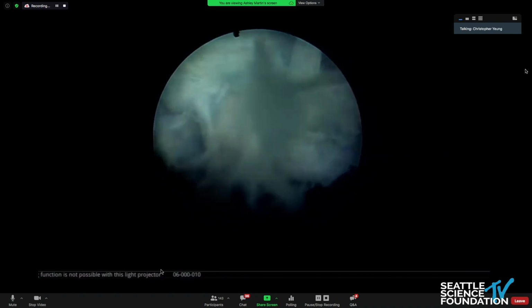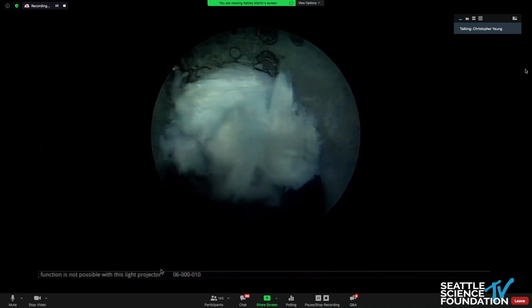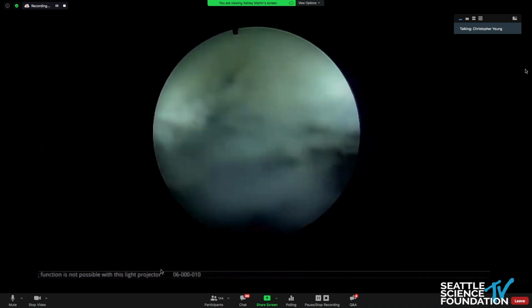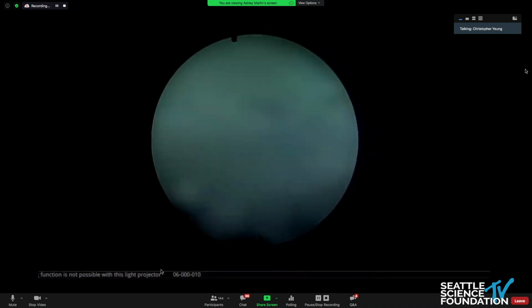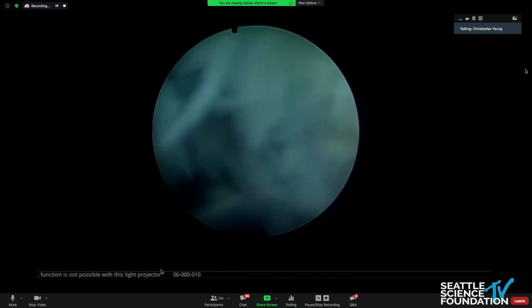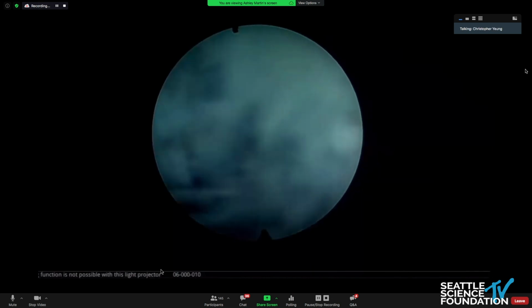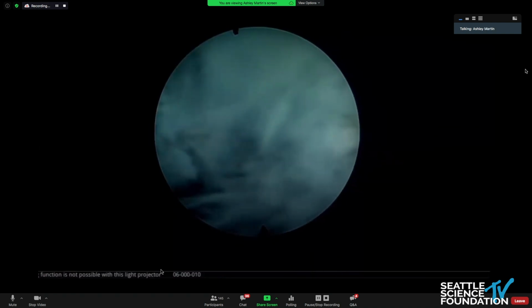So typically, if I'm going to go in the disc space for discectomy, I'll usually like to start in the disc and then pull out, because disc is home. Just like when you're doing a bone, bone is home, and that kind of orients you. Your disc is home, and then you can come out from there. So this is just kind of starting.